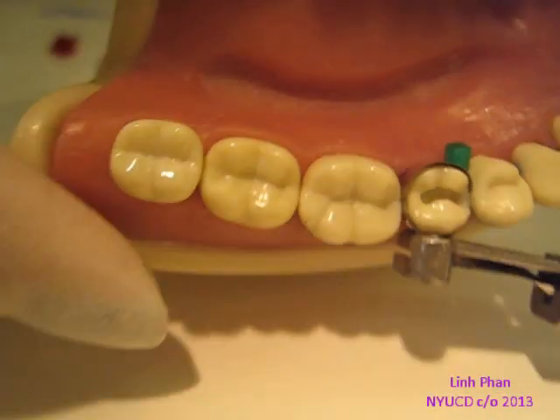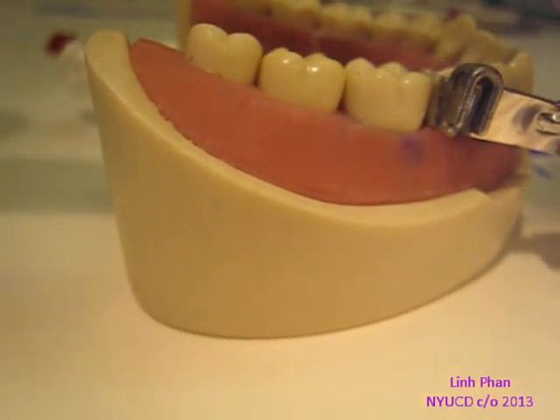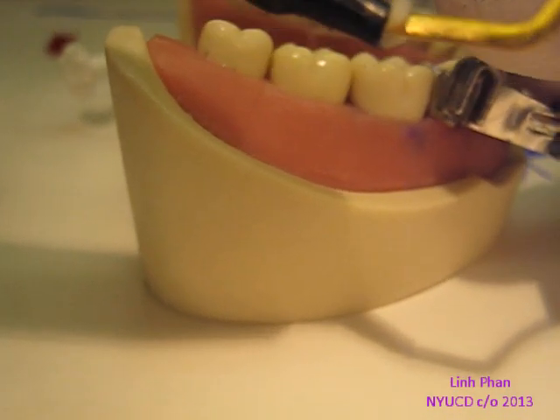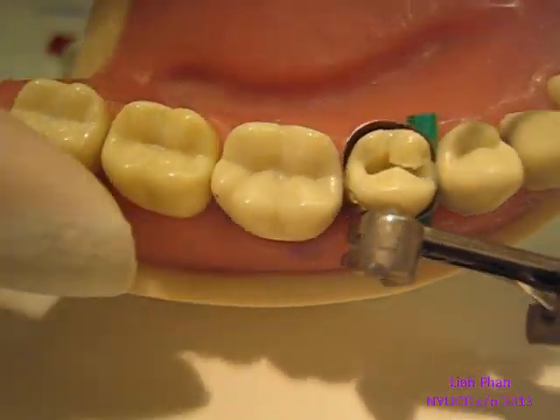To do it, grab a little more. I'm going to start using the gold instrument or the plastic instrument. Dip it in a little bit of bond, just a little bit. We're going to take a little bit of composite. Why do you switch instruments? Because I want a flat instrument to help me with the cusp. I usually do one cusp at a time.